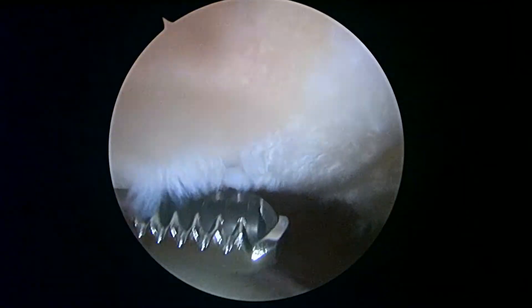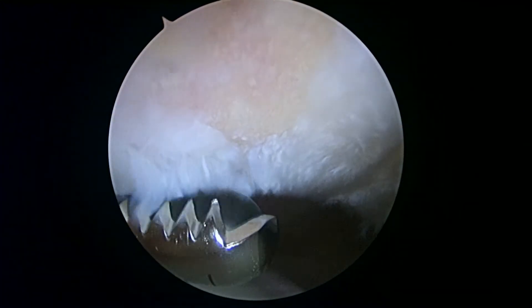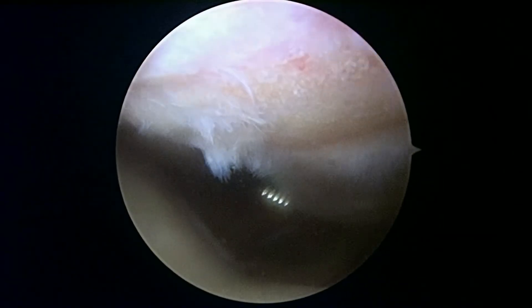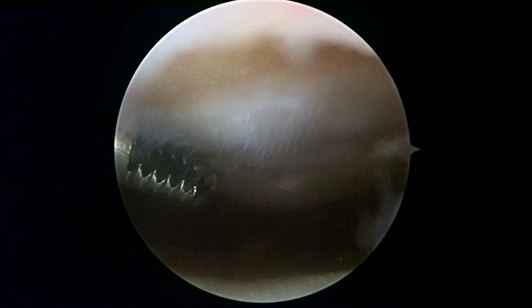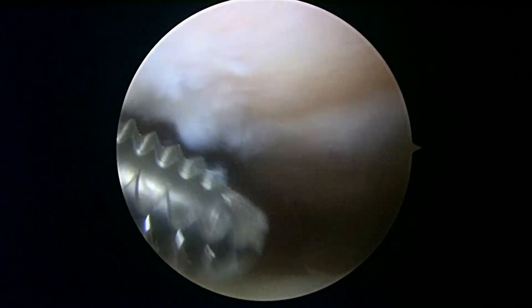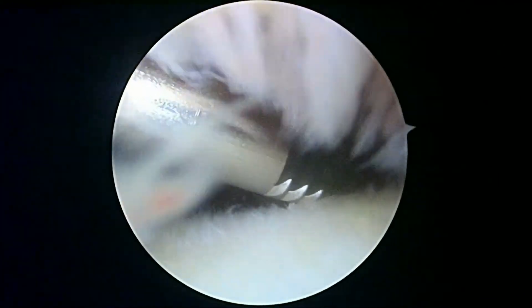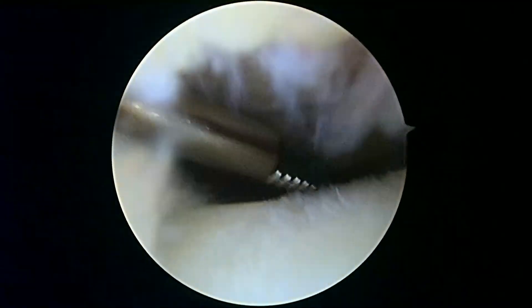That's obviously not great. Between the medial compartment and this patellofemoral joint, you've got real end-stage arthritic changes — bone-on-bone even more than your x-ray would suggest. I'm going to want you to be as active as you can possibly be for as long as you can, and we'll try to manage your symptoms as best we can. It won't be perfect, but hopefully enough to keep you active. We're going to finish up here and get you back to the recovery room shortly. Good luck to you.